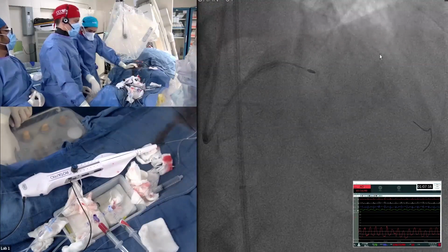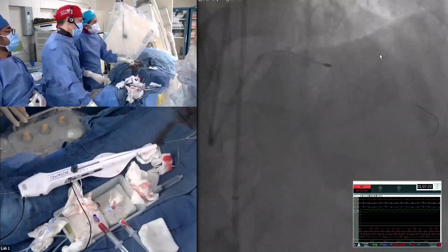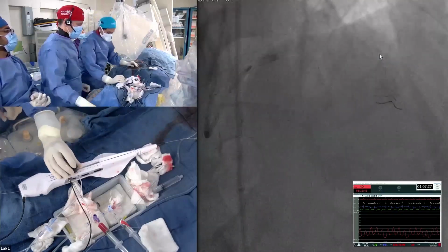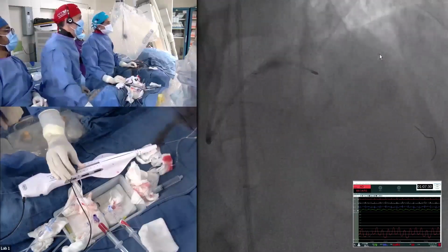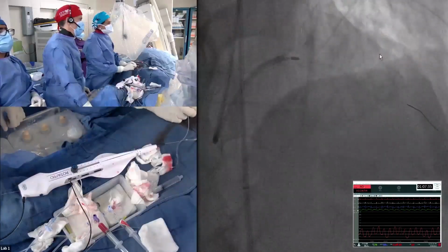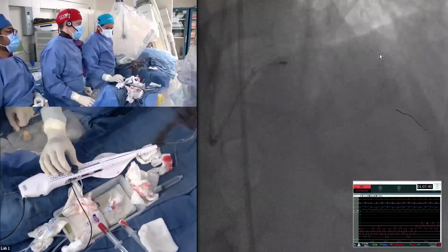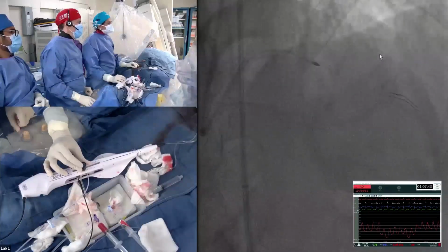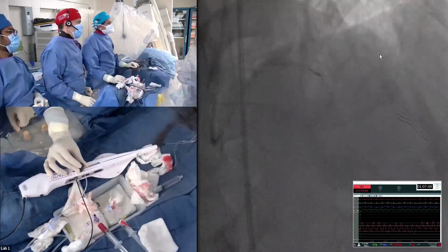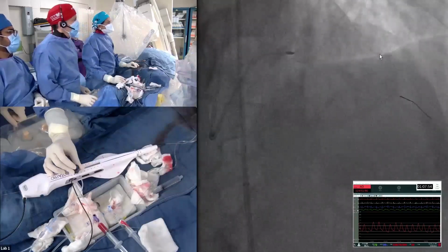Yes. Wire was also coming back. Your guide is very, okay, let's see now. Yeah. See that? Yes. But we want to polish the ostium. There it is. And do you see a drop in the RPM, Dr. Keeney? No, no. Okay, that's a good sign. There you go, you just did it. You see that? Yeah, we saw that, you just ablated it.